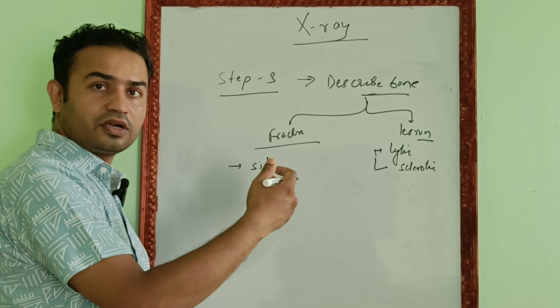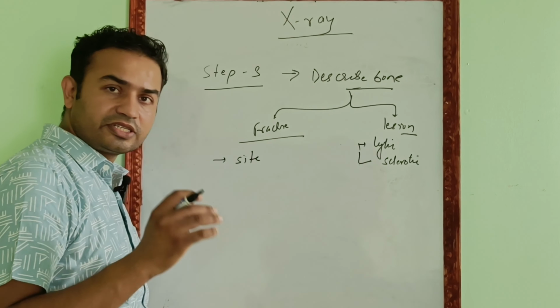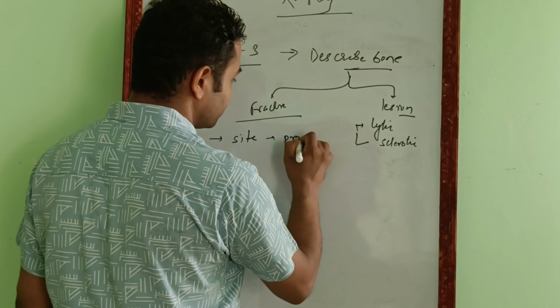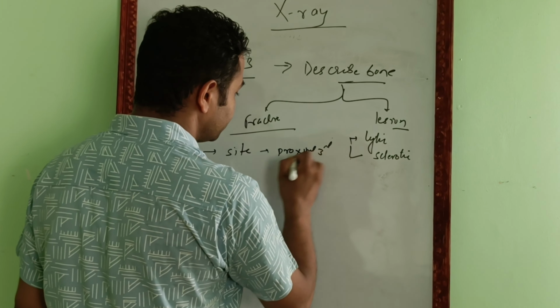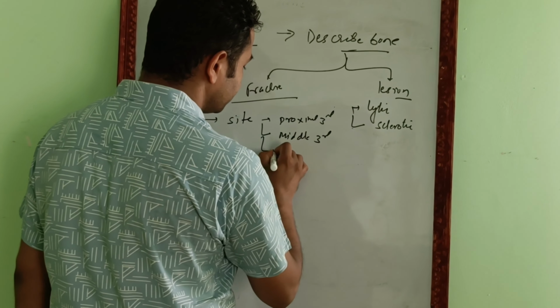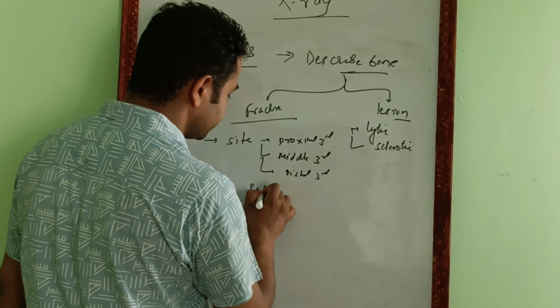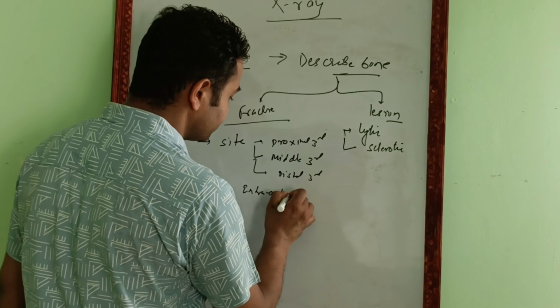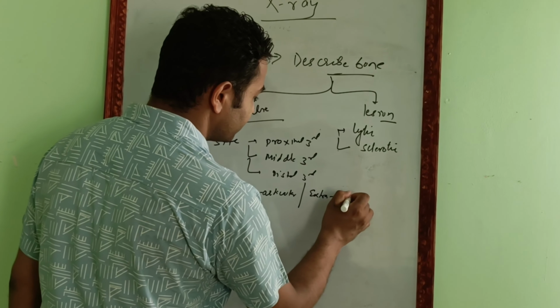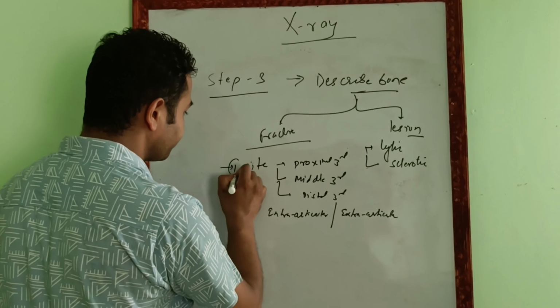The fracture is at the proximal third, middle third, or distal third, and whether the fracture is intra-articular or extra-articular.